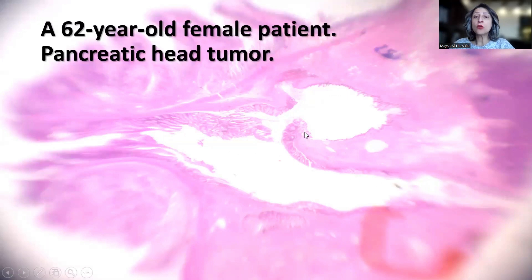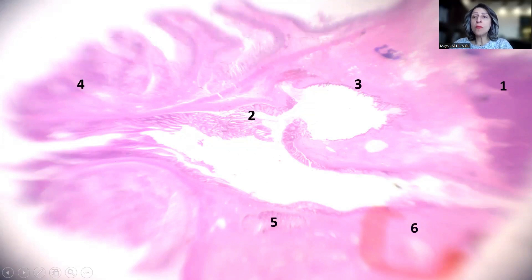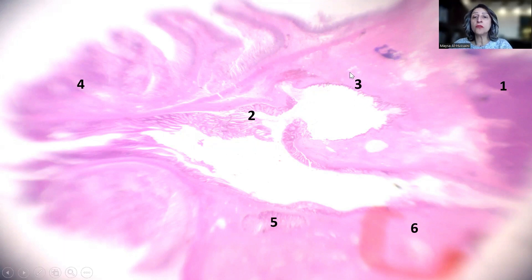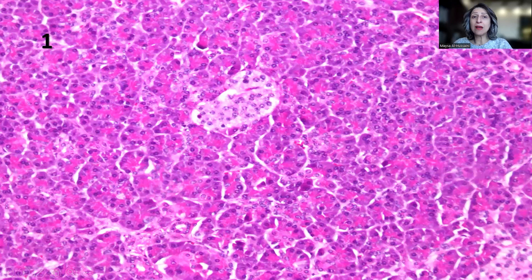As you can see here, the growth is really invaginating and then continuing until the ampulla of Vater. I'm going to be zooming in at multiple foci — the normal pancreas, the main pancreatic duct to discuss the lining epithelium, the invaginating growth, what happened at the ampulla of Vater, one of the branching ducts, and then one of the foci of the colloid carcinoma.